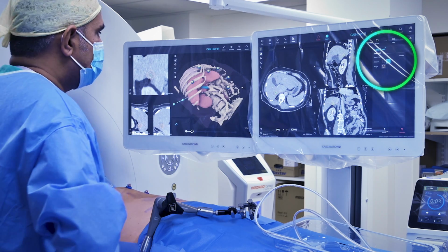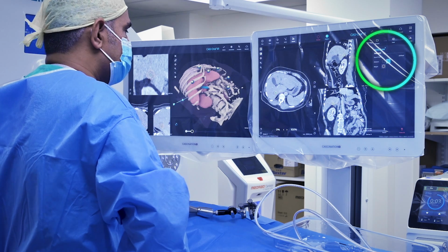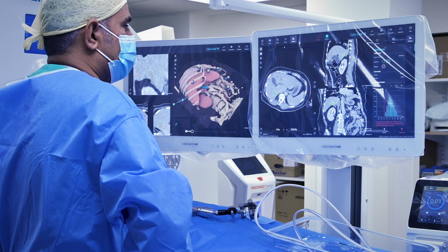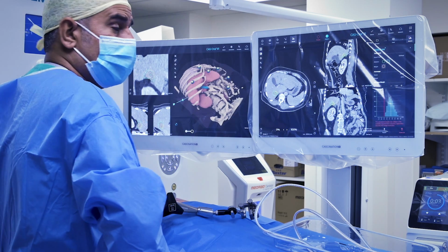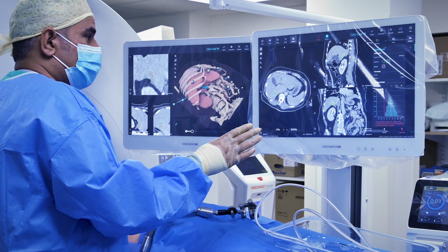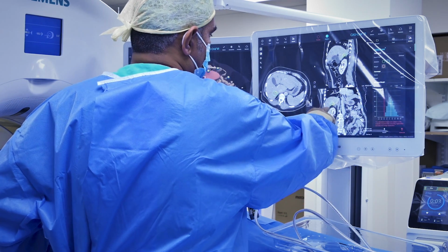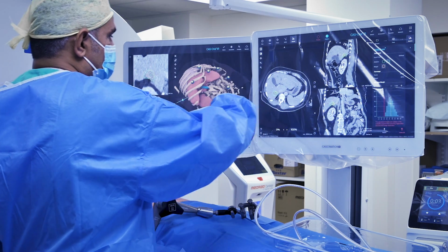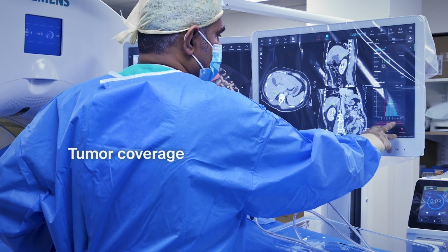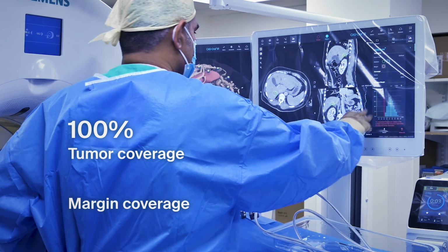The new artificial intelligence features enable much better segmentation than was previously possible. It's kind of thinking about that. And what we're seeing there is actually a really, really effective result. What we have on the right-hand side is our coverage compared to our original tumour. We see the green circle being the ablation zone, and we are now seeing tumour coverage at 100% and margin coverage at 90%.